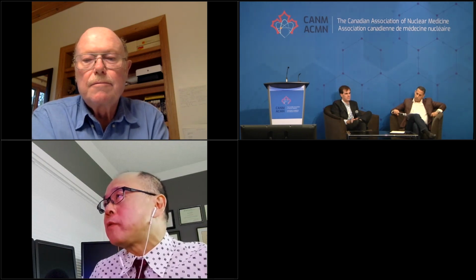Oh, okay. Yeah, I think the literature is controversial on this, but I think there is general agreement that, first of all, it is important to know what white cell tracer you're dealing with, and in that regard, I've pointed out from the start of my talk that in our department, we've been using the technetium white cell for years, for at least 30 years, for as long as I've been practicing. And in fact, on a personal note, I'm thankful to Dr. Kloiber, who gave me the opportunity to have some experience with indium white cell, because that's what he used in his department prior to PET-CT.